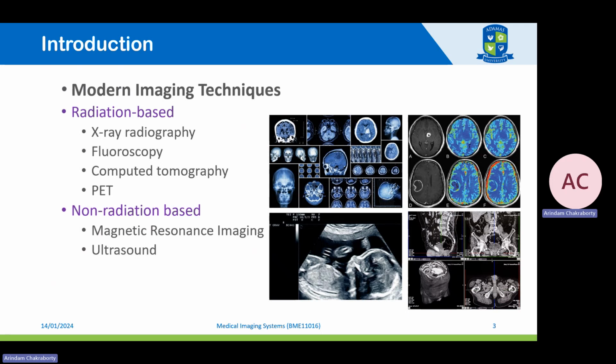There are several modalities of imaging technique used in modern-day clinical settings. We can broadly classify them as radiation based or non-radiation based, depending on the source of the image producing system. The most popular radiation-based one is X-ray radiography, along with fluoroscopy and computed tomography, which also uses X-rays but has more sophisticated physics and instrumentation for better visualizing internal structures.